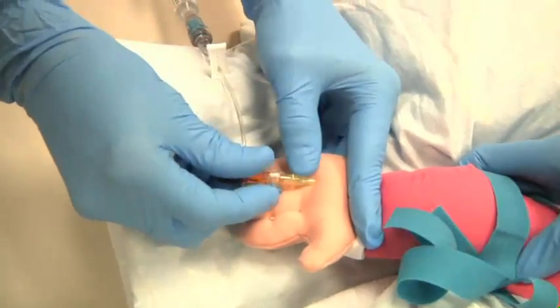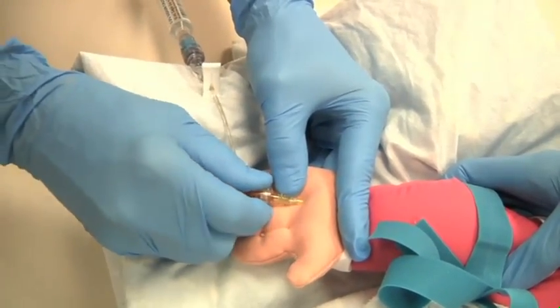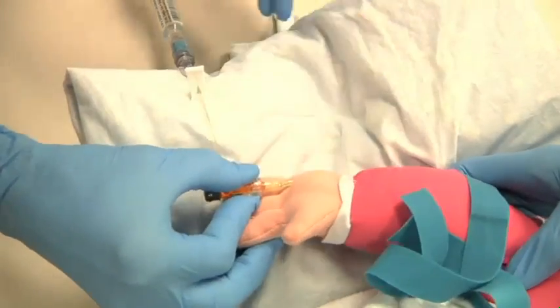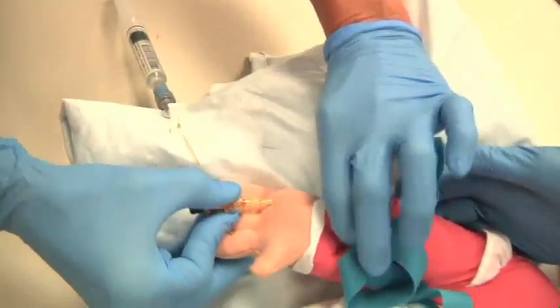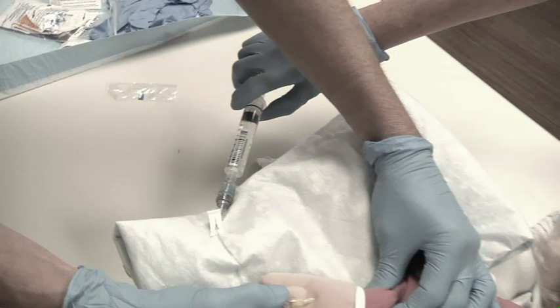Apply pressure on the vein above the tip of the catheter, control bleeding, and connect the T connector to the hub. Flush the catheter and watch for any signs of infiltration and assess for pain. Leave the syringe attached.